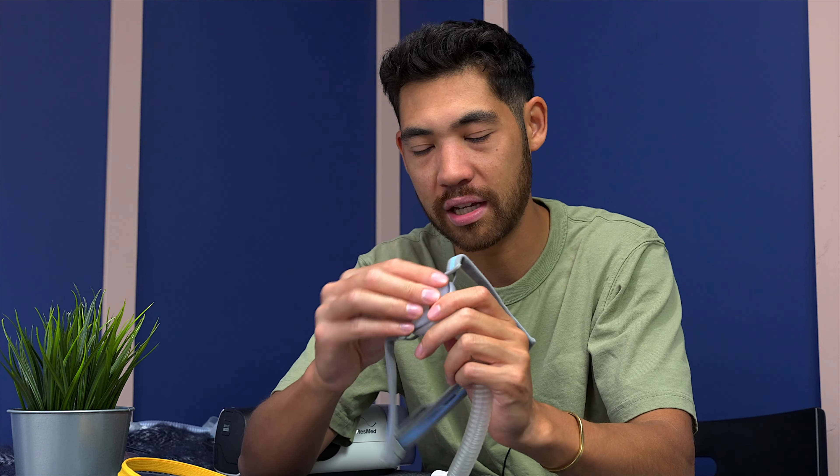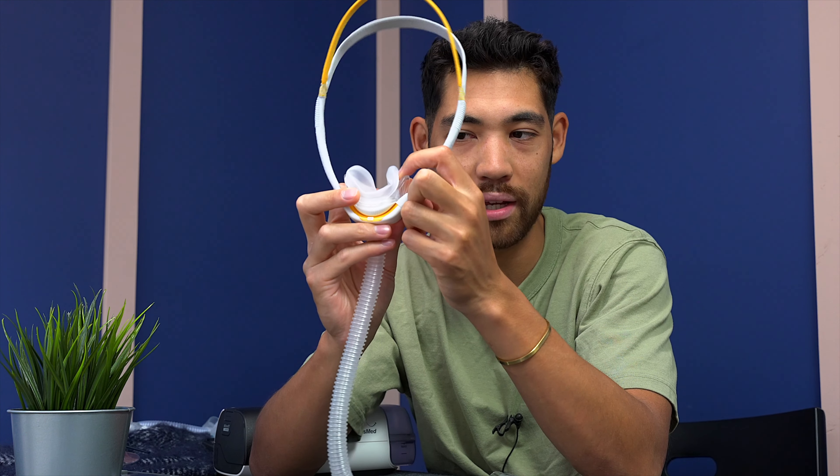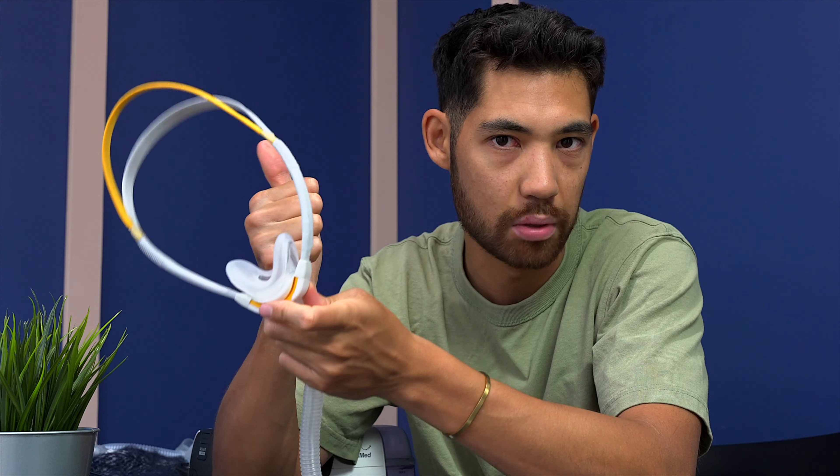Whereas with the P10 and the N30, there's no hard plastic around that area. You can squish it as much as you want into your nose and nothing is digging on the side. So in terms of cushion comfort, I would say the P10 is better. In terms of initial sealing, I would also say the P10 and N30 are better — when you just put them on, they seal nicely. I really want to try the pillow version of the Solo because I don't think it has the wings, and from what I saw in person it looked really, really good. But for now, comparing this cradle Solo versus P10 or N30, the nasal cushion area is a little more comfortable on the ResMed.